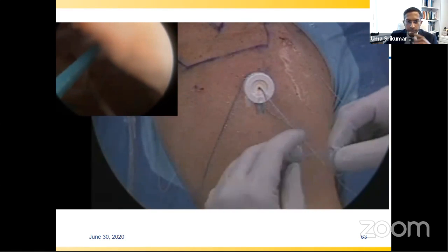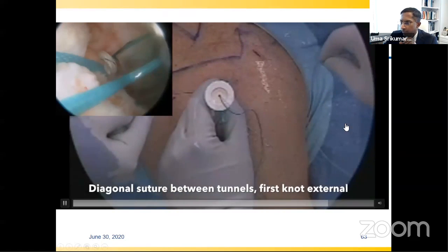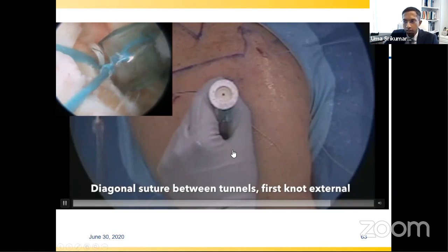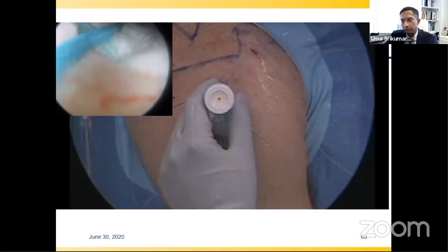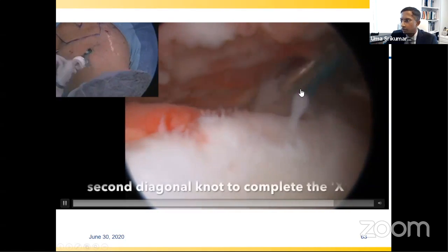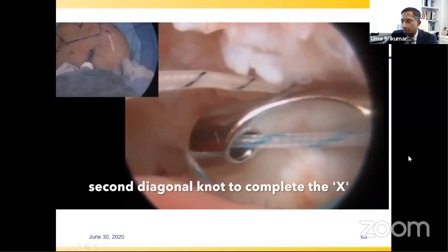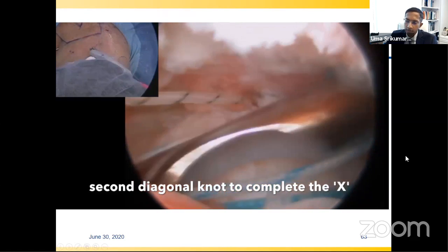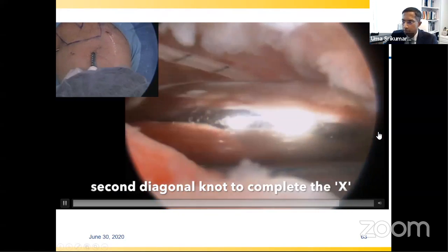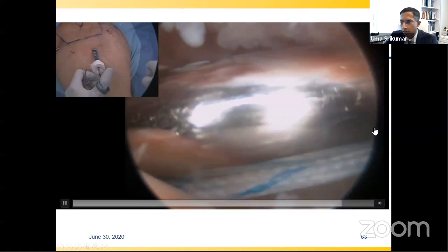So instead of just simple ties where you can get compression across the footprint, you can now pick two different colors of sutures from two different tunnels and cross them as well to achieve different angles of compression. This is purely surgeon preference. So that's why you see two different strands, two different colors of sutures, or two different independent sutures that have been tied together outside the body, and then their other ends tied inside the body, delivering a cross-hatched pattern and allowing for some compression across different angles of the rotator cuff tendon.